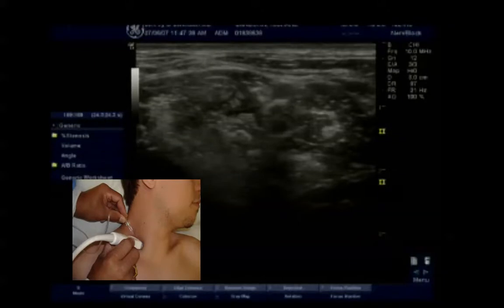This is an example of a brachial plexus approach at the interscalene level going through the middle scalene muscle. We have the brachial plexus surrounded by the white oval. The middle scalene is on the left and the anterior scalene is on the right. Now we have injected a small amount of local anesthetic into the substance of the middle scalene muscle on the left, which is why the appearance of the middle scalene muscle is a little different than the anterior scalene.